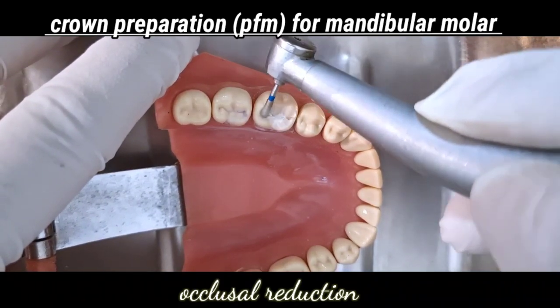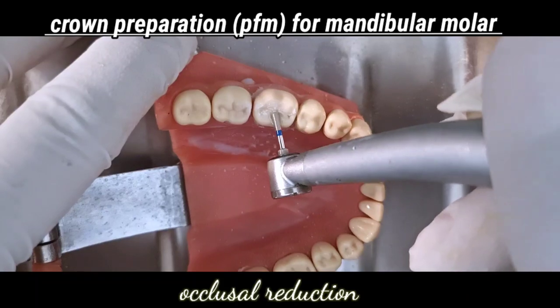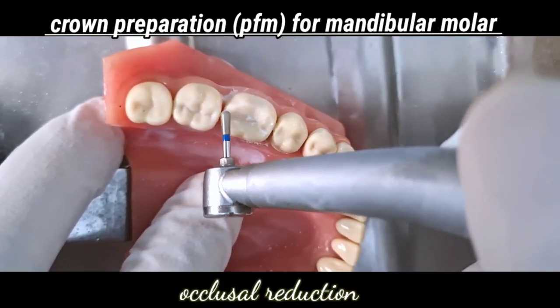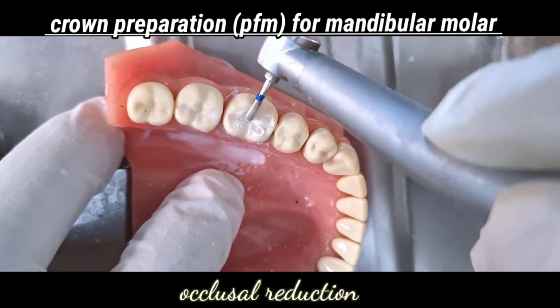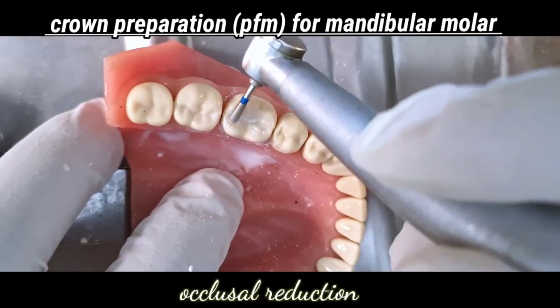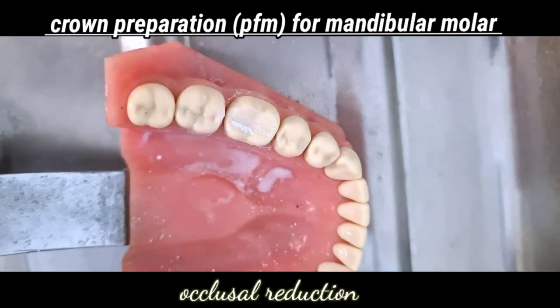Remember guys, it is very important to make adequate room to accommodate the metal as well as to mask the porcelain over the metal. So in order to make a PFM, we have to make sufficient room for the metal as well as to mask the porcelain over the metal. The tooth must be adequately prepared to have a successful PFM crown. We check the occlusal anatomy with the help of this putty index.